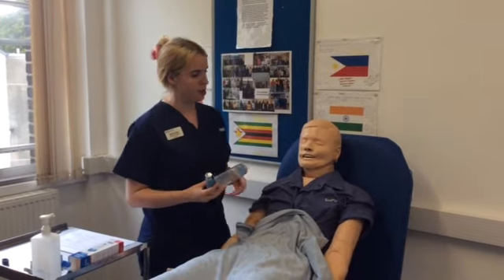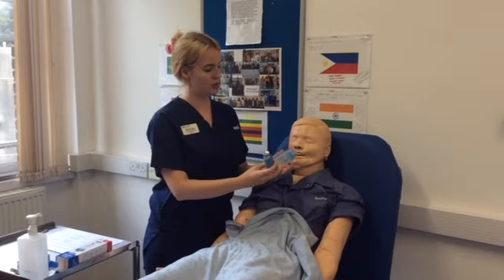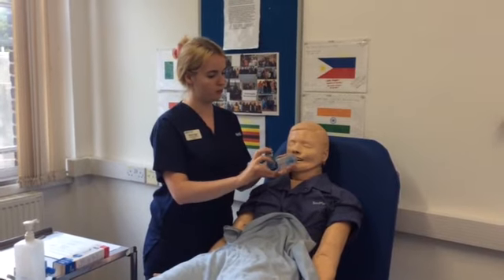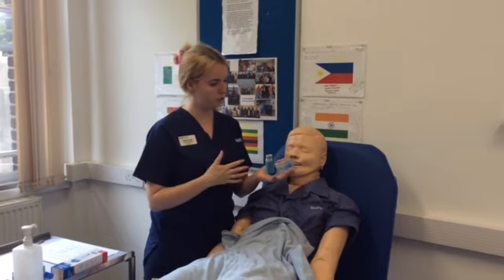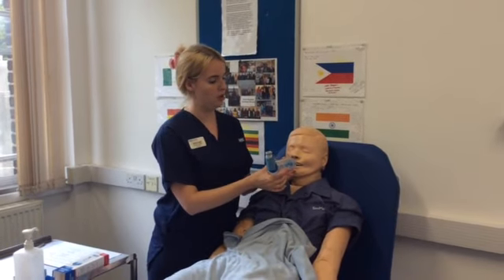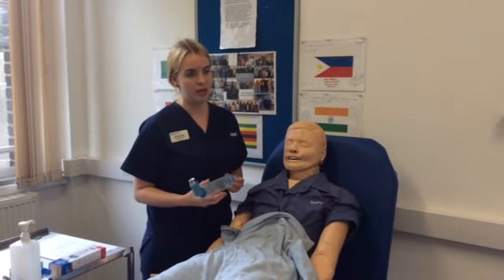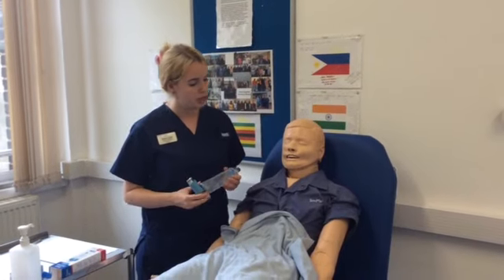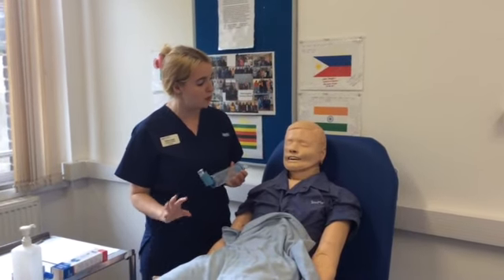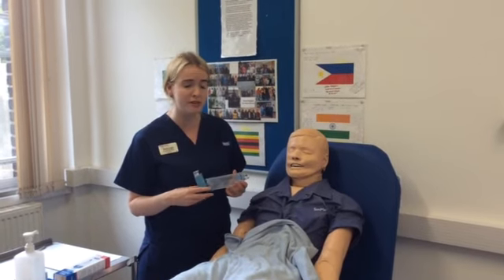Okay. So deep breath in, breathe out, put this in your mouth, make a seal, press the canister fully, breathe normally for 2 to 5 seconds, remove this and breathe out. Okay. How do you feel now? Oh, that was fine, thank you. So we'll just wait a little while, so you need to wait about 30 seconds in between doses, and then we'll proceed and do the same thing again.